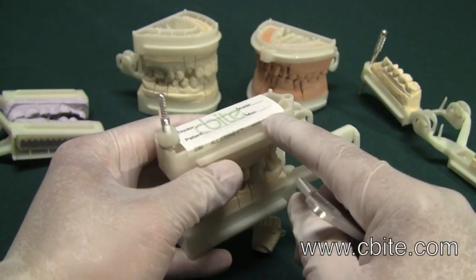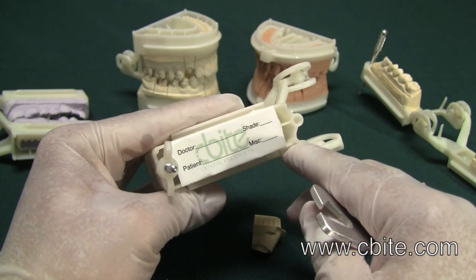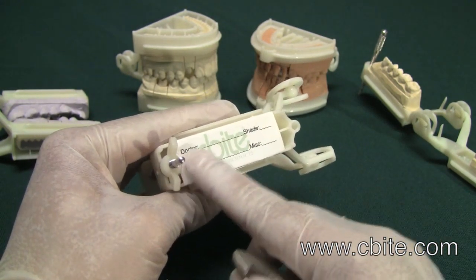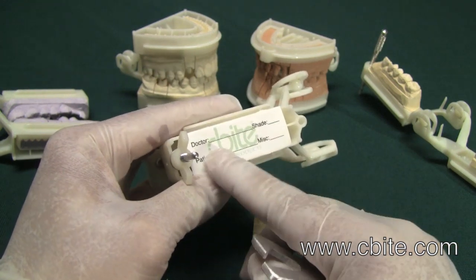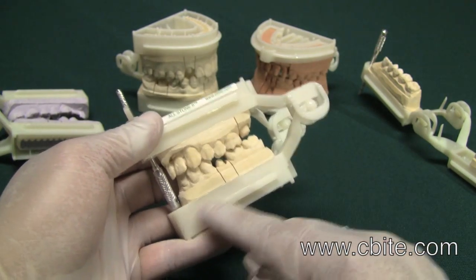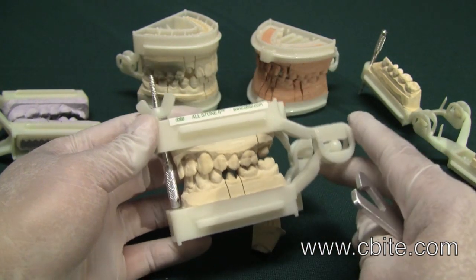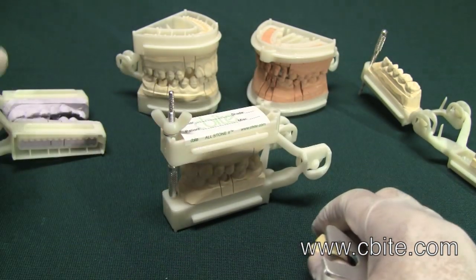We have also provided a doctor-patient label. It is a waterproof label that allows you to write all the information you need on the case, so you do not have to write it all over the articulator. It makes everything a lot nicer, cleaner, and more professional looking.